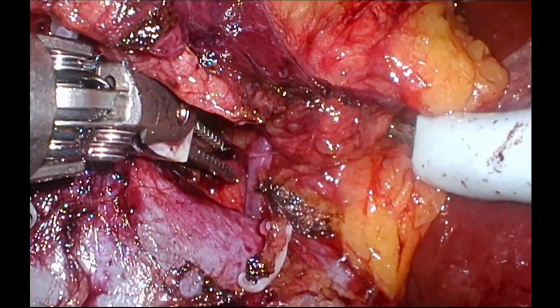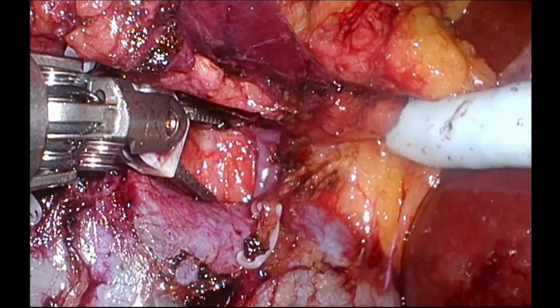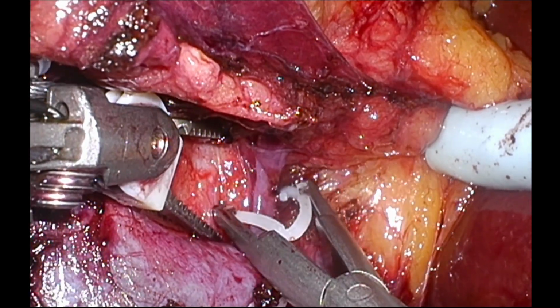Accessory renal vein superior to the main renal vein is dissected. It is clipped and cut between the clips.